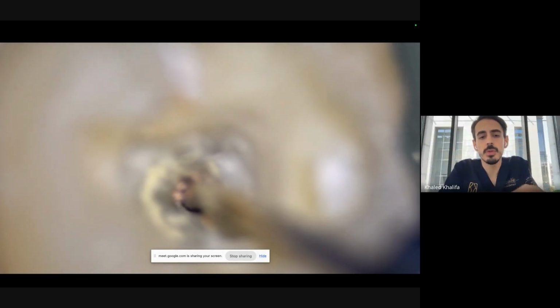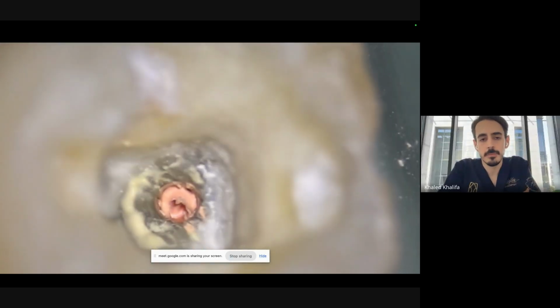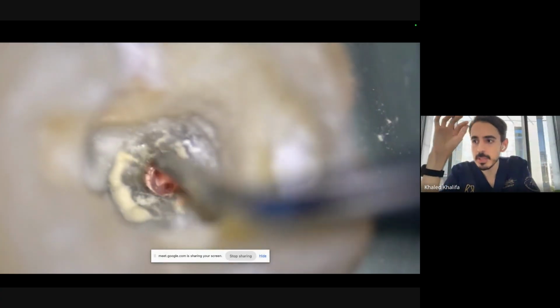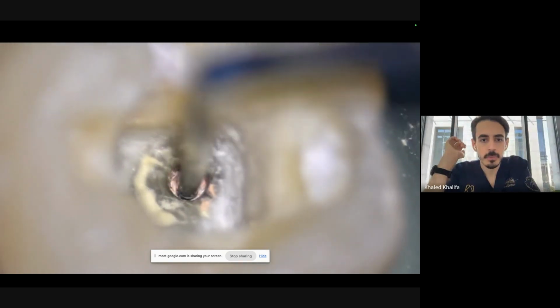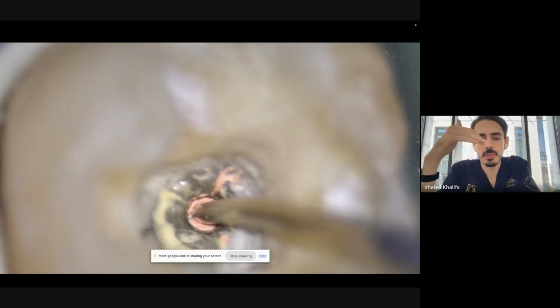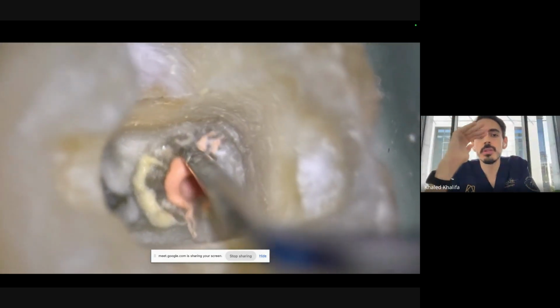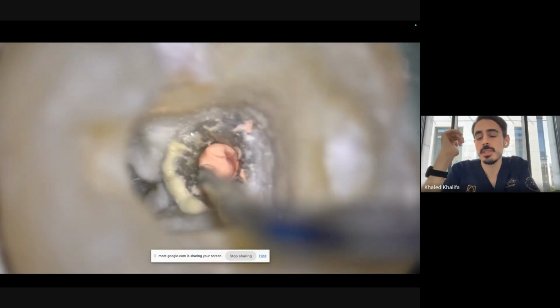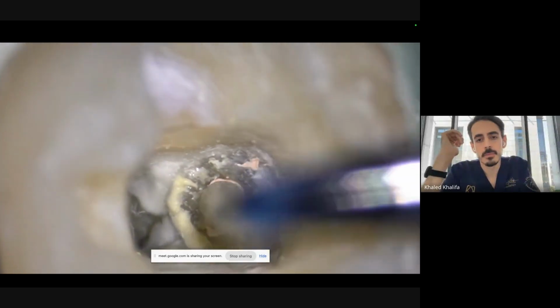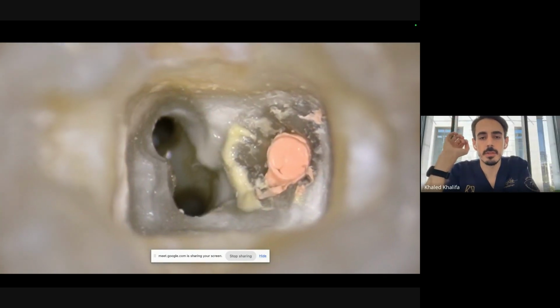After making sure of this, we're gonna start injecting thermoplastic Gutta-percha over increments. And you have to touch the old Gutta-percha inside in order not to make an air bubble inside. Okay? And here is the first wave. That's why it's called continuous wave obturation. This is the first wave, and this is the second wave of injection. And you can notice there is no voids between the increments. This is very important. And this is how to achieve a 3D seal using resin-based sealers.